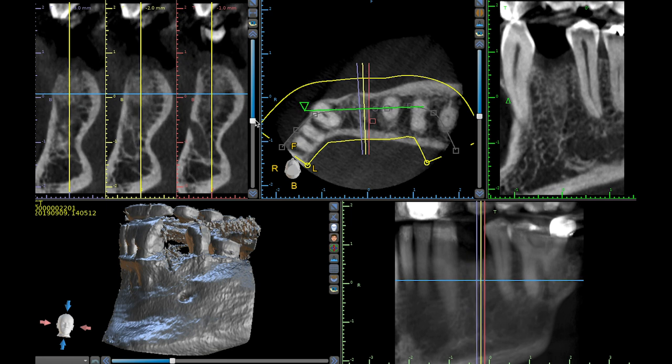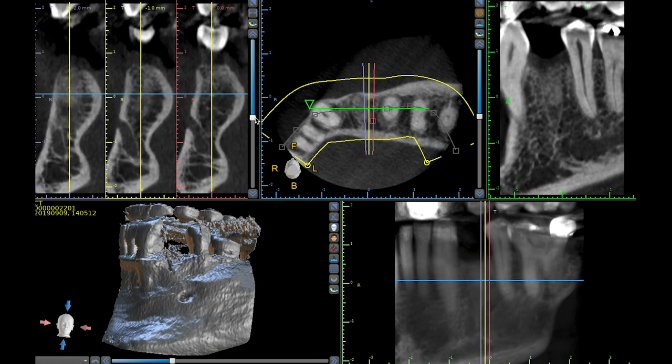Let's go back. As I scroll back a little bit more, it's just at the distal portion of that edentulous space — that's where it's exiting. The mental foramen is right here and the nerve exits through here. I'm going to get a measure from that nerve to the crest of the ridge — that looks like 13.8 millimeters. I want to stay a little farther away from it, so we can place an 11 millimeter or 10 millimeter implant and still be safe. As far as width, we can place a 4.3 — we could go even wider, but for a premolar I think 4.3 works out pretty nicely. So let's look at the procedure.